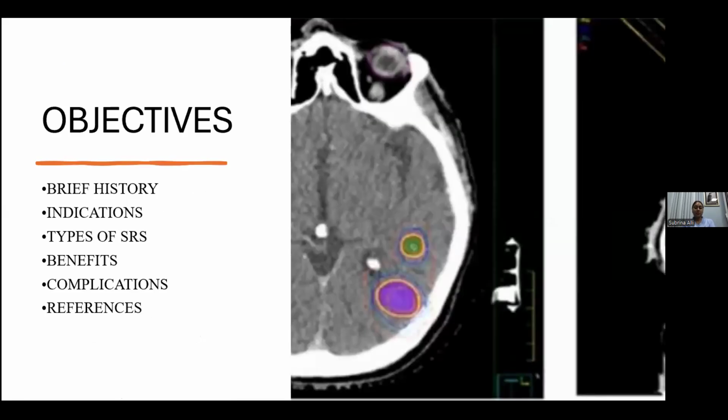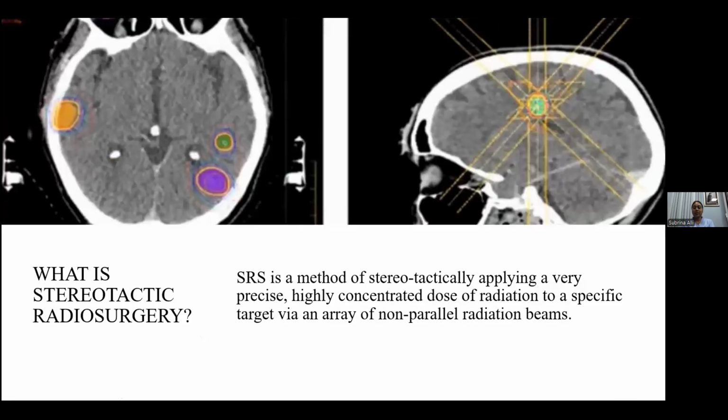Our objectives tonight include a brief history, indications and types of stereotactic radiosurgery, and the benefits and its complications. Tonight we'll be going directly into what is stereotactic radiosurgery.